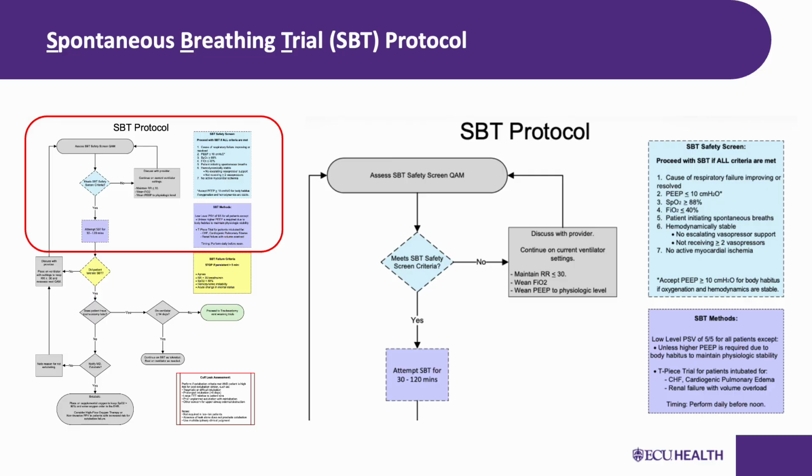Okay, now we're at one of the most clinically important parts of this protocol, actually performing the spontaneous breathing trial. If the patient has passed the safety screen, their RASS is -2 or better, and you have communicated with nursing, it's time to trial. Look at the flow chart. Once all the criteria are met, we proceed with SBT, and the trial duration is 30 to 120 minutes.